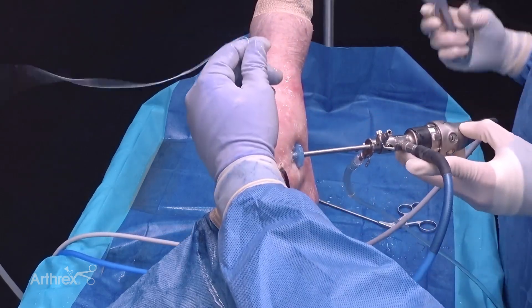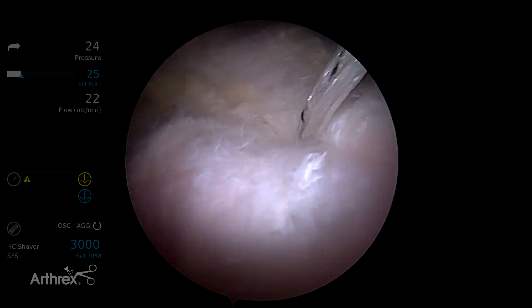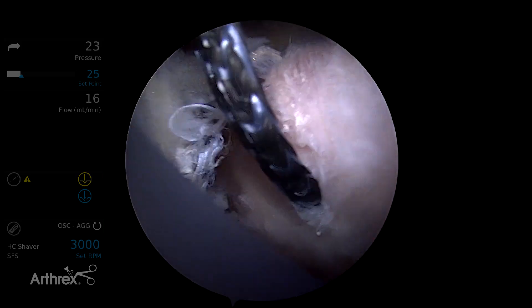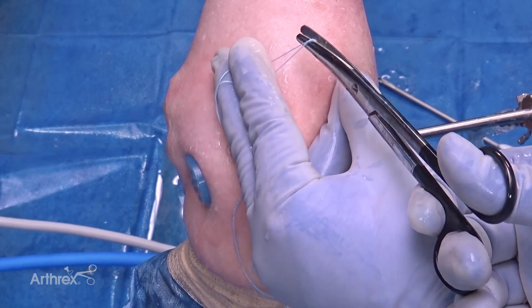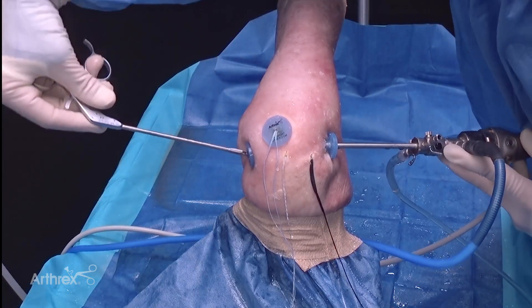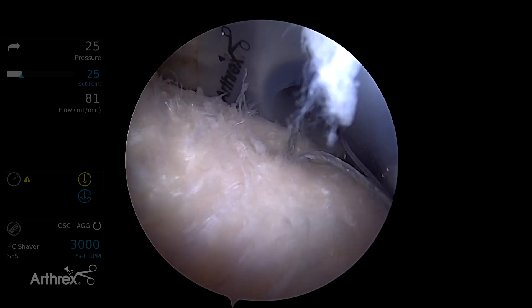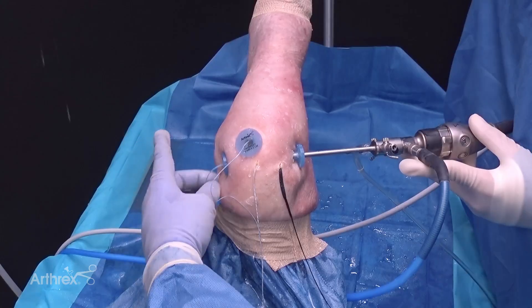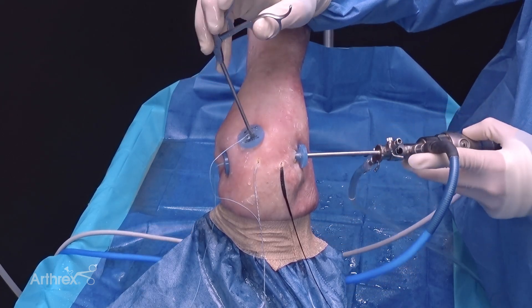Now we have all three sets of fiber tape passed through the tissue — anterior, middle, and posterior. Next we need to cut the ends of the fiber tape to separate the two fiber tape limbs. We retrieve one of the limbs from the anterior anchor out the ASL portal; the other limb is left out the lateral portal. We then need to retrieve one limb from the middle and the posterior anchor.